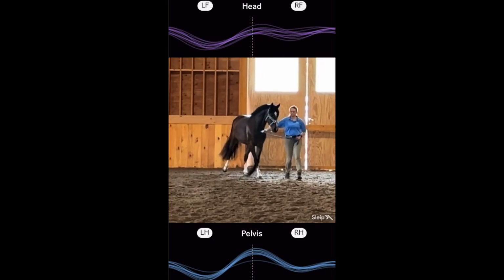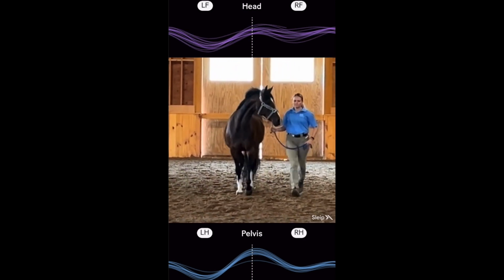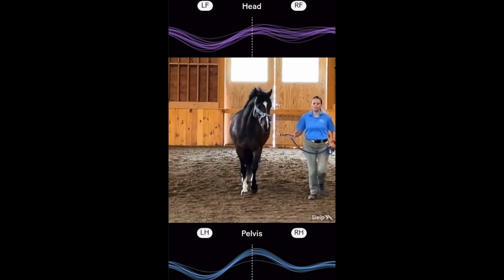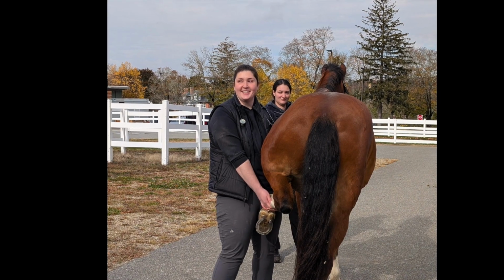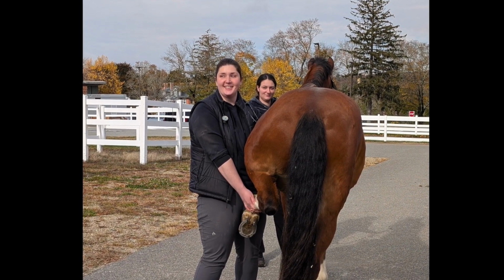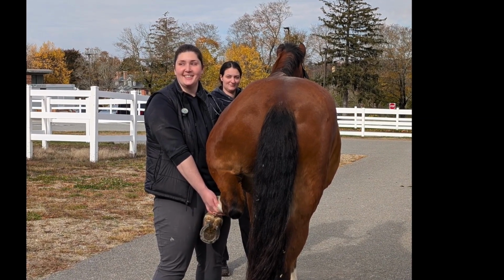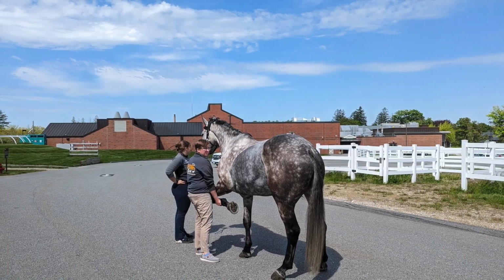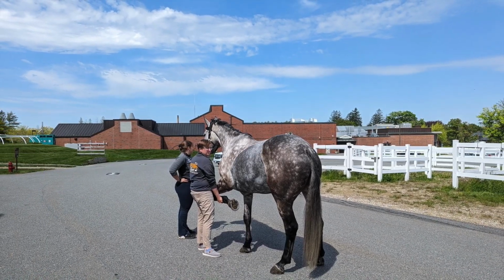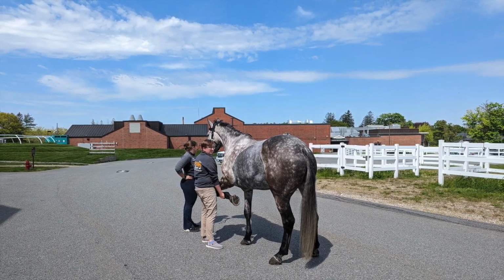There are numerous benefits of an objective gait analysis system to the clinician. Arguably most useful is providing accurate and repeatable data in cases of mild lameness. This improves communication between clinicians and provides visual documentation for the horse owner. Objective data can also be used to compare responses to flexion tests, local analgesia, and at recheck examinations. Unfortunately, some subtle lamenesses are only evident when the horse is being ridden or under specific conditions. Therefore, subjective gait evaluation remains an important part of the lameness examination, with objective analysis systems supplementing the clinician.